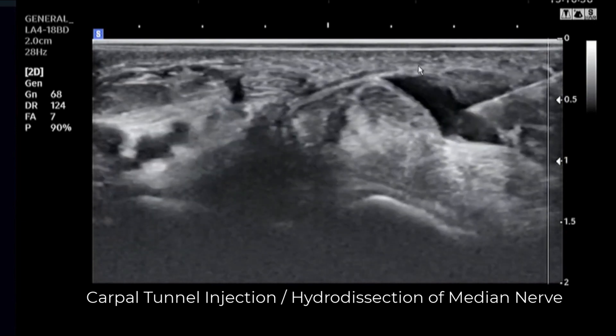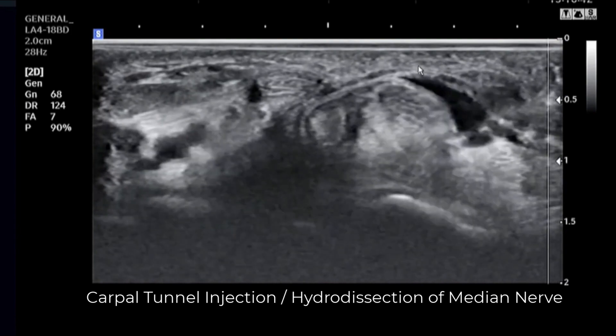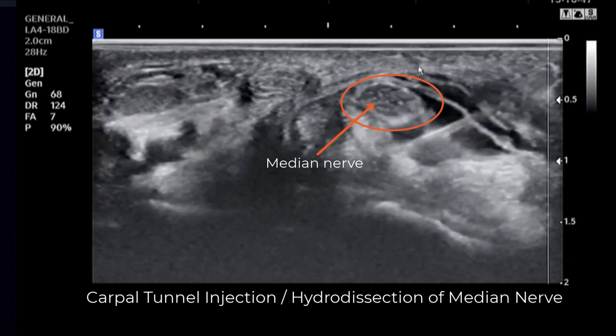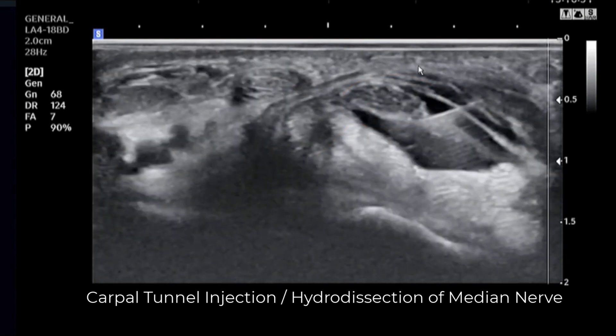In our example today, the patient had carpal tunnel symptoms and opted to have a hydrodissection performed for relief of symptoms. This technique can also be used as a decision-making aid in determining if a carpal tunnel release will likely provide lasting relief for those with mild to moderate symptoms.